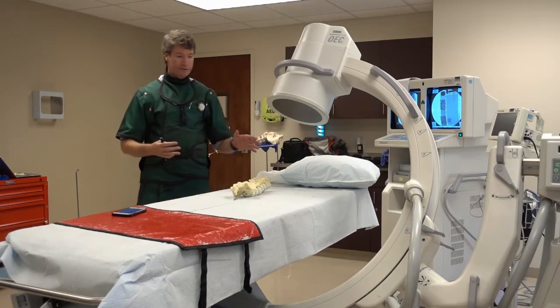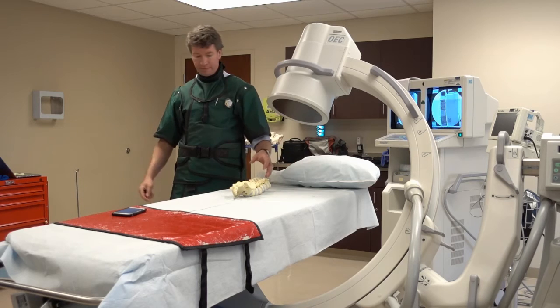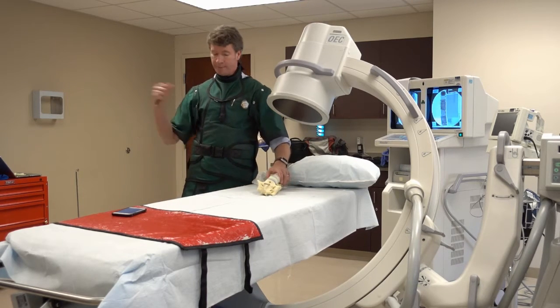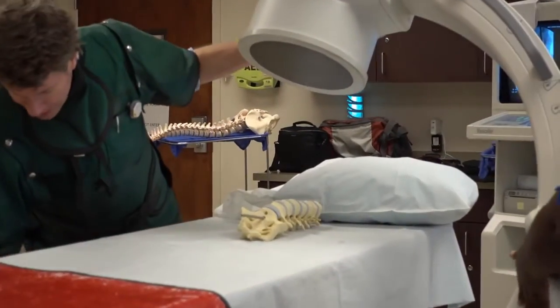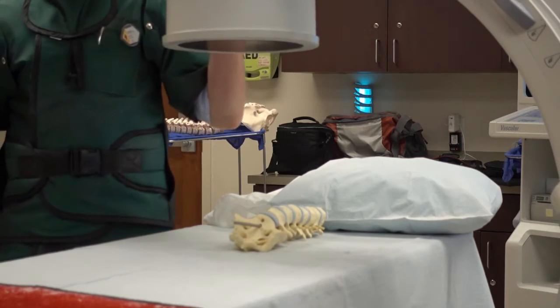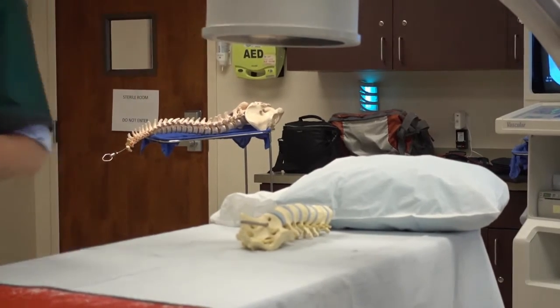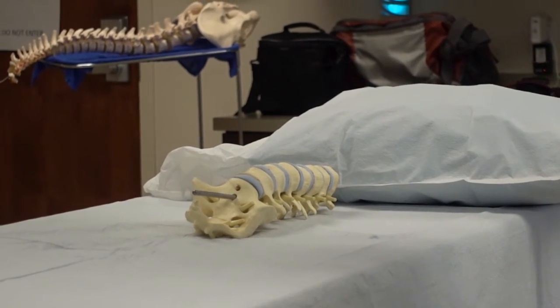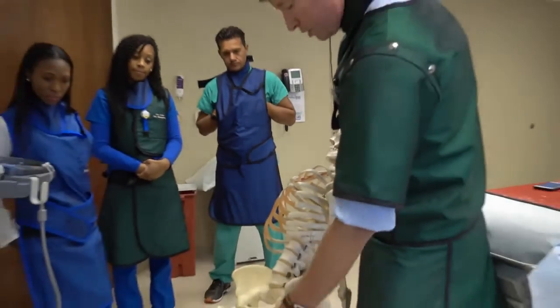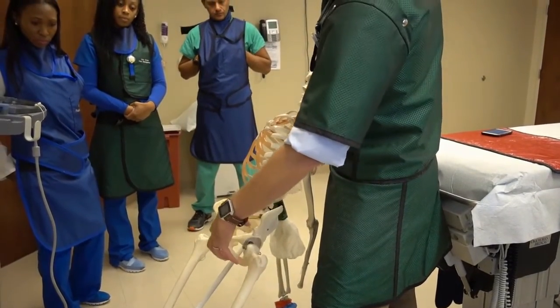You can do the hip two ways. Generally what we do is you have the patient lie on their back, which is probably easiest for the patient. So they're lying on their back in the supine position, like this. And what we try to do is project the hip in a perfectly AP projection. So we come down, we get a picture of the hip, and we can go over here to our skeleton. What we'd see is the ball of the hip in the acetabulum, then the neck, then these things called the trochanters, the lesser and greater trochanter. Basically we want to project it so we see those things on the screen.